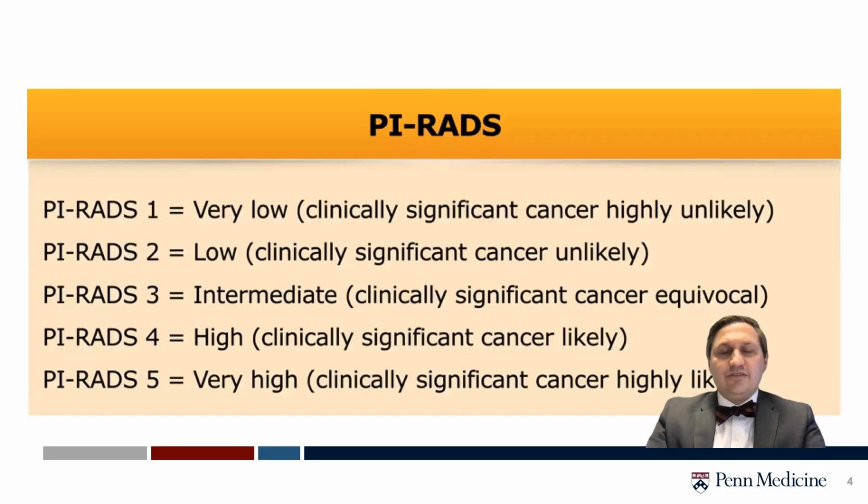The PIRADS scale is actually an international scale that lets any radiologist figure out what is going on with your prostate on a standardized scale. So you could go to any hospital in the country, and likely they would use just about the same scoring for your prostate. From the urology perspective, we are most interested in finding patients with PIRADS 3, 4, and 5 lesions. And then you might wonder, well, what about lesions 1 and 2?